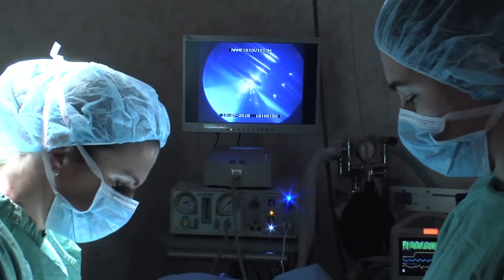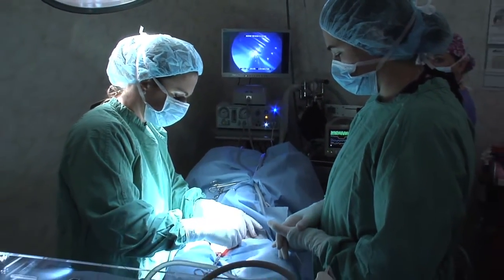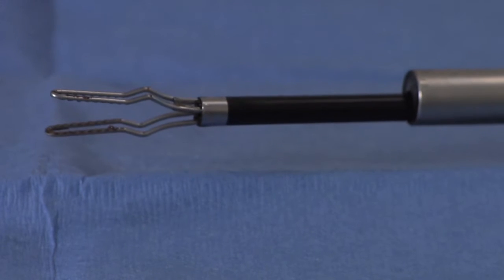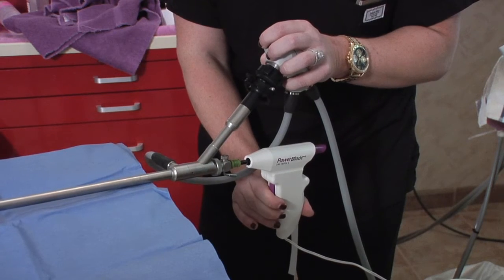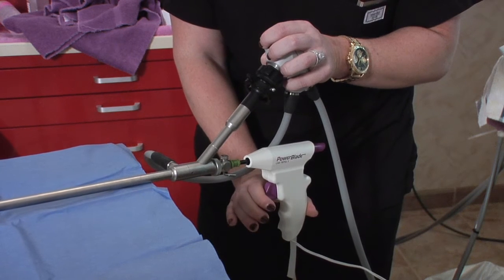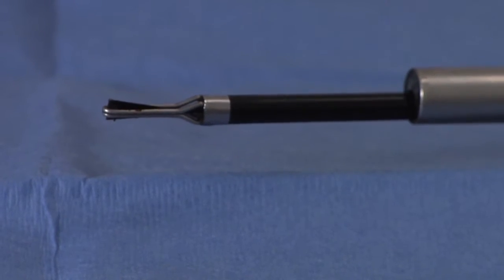That has been associated with a decreased amount of pain after surgery and a faster recovery after surgery as well, which is great because that is our main goal. This is what we actually use to grab blood vessels and cauterize them, which is basically using heat to close the blood vessels. And then this little button — push this — and the little blade comes out to actually cut the tissue.